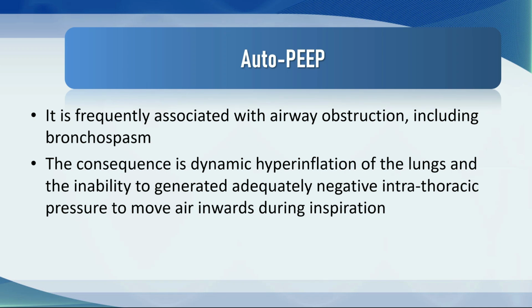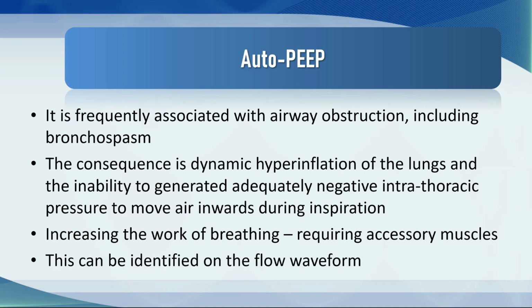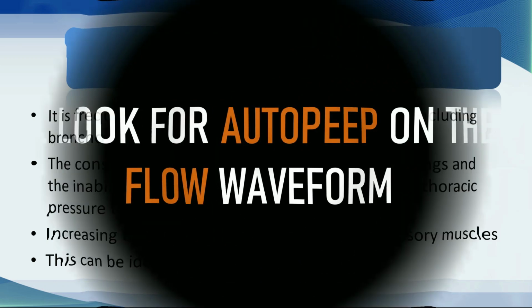spontaneous breathing particularly difficult because the patient must generate a much greater negative pleural pressure to trigger the ventilator. And this increases the work of breathing and may lead to exhaustion and progressive hypercarbia and hyperinflation. If you want to look for Auto-PEEP, the first place you can look is at the flow waveform.